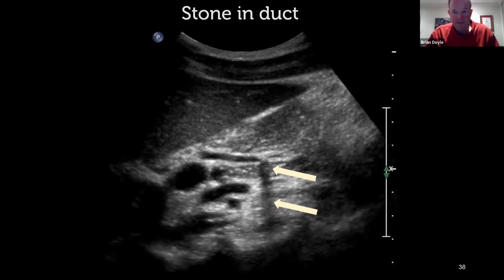Anne, I'm glad you said that. This is Brian here, because it took me a long time to get comfortable looking at the common bile duct, so that makes me feel better. A really quick question, though, about patient positioning. I think you had mentioned that you like to have your patients in the left lateral decubitus position. Is that how you start off all of your biliary and common bile duct measurements? You just cut to the chase, have the patient on the left lateral decubitus, or you start off supine?